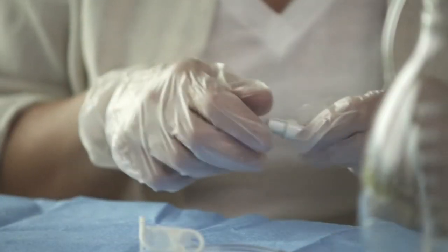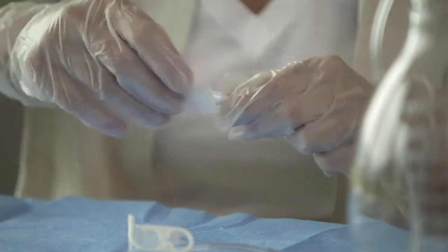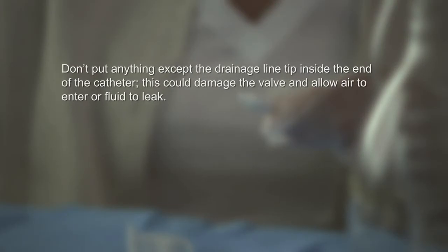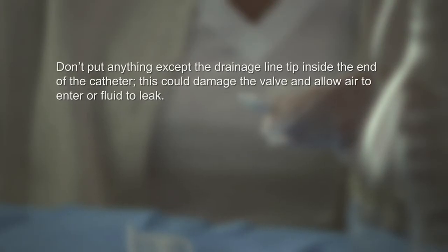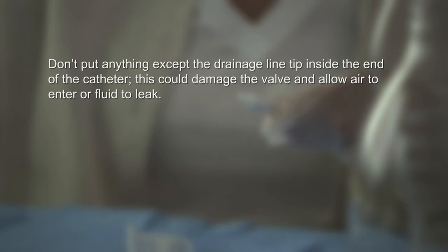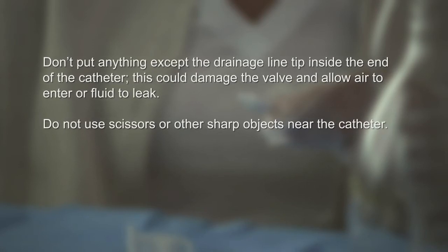Holding the catheter near the end, remove and discard the cap from the end of the catheter. Use an alcohol pad to clean around the opening, but don't try to clean the inside. Don't put anything except the drainage line tip inside the end of the catheter. This could damage the valve and allow air to enter or fluid to leak. Do not use scissors or other sharp objects near the catheter.